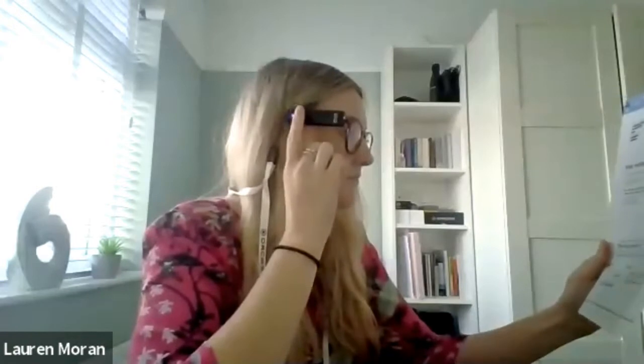So I'm going to ask what the amounts are, I want to know how much my bill is. I'm going to ask what date it is, so what date does it refer to, and then I'm going to ask what are the phone numbers, how am I going to pay this bill? I'm going to ring up, so I'm going to need the phone numbers. So I'm going to demonstrate that feature now. I'm going to pick out those three things and let's see what it picks up. Okay, so I'm going to double tap the side of the device.